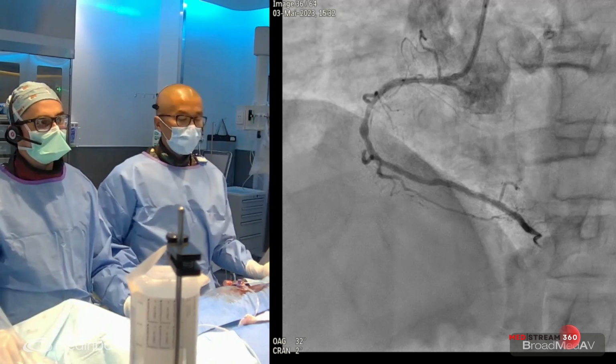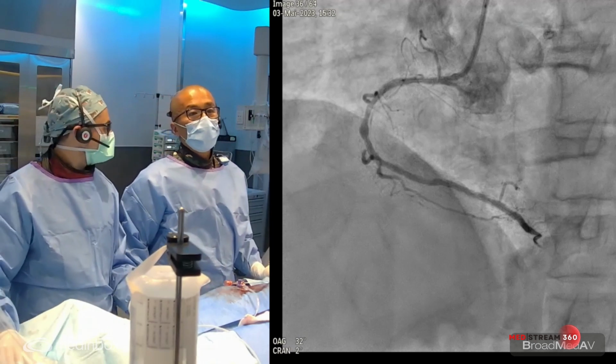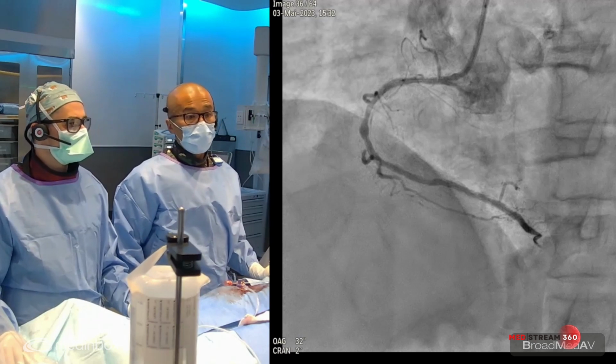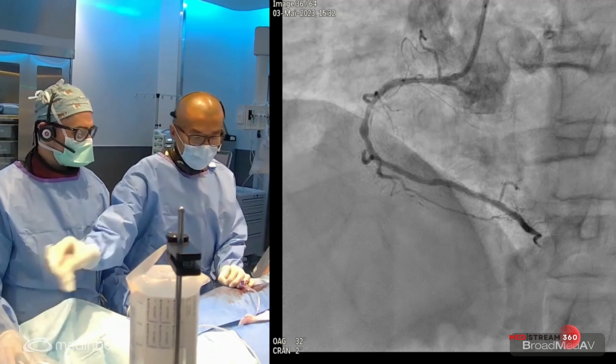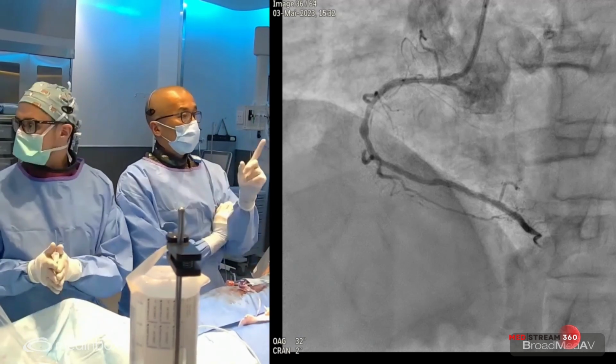And will minimize also the risk of restenosis. It is a very long stent, which will increase the risk of restenosis. But, however, in this patient, there's disease everywhere. And also my strategy to try to use one stent is to have fewer issues with overlap. Exactly.